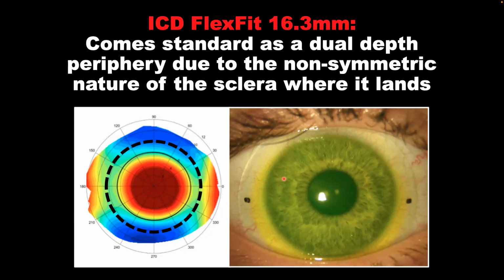So whenever you are seeing a topography with the rule or against the rule, don't expect the lens to settle in that flat axis. Just be aware of where those hash marks settle, because that's going to be very useful whenever you're doing a bitoric lens, because that marks where the lens is stable. So you have to be very careful.